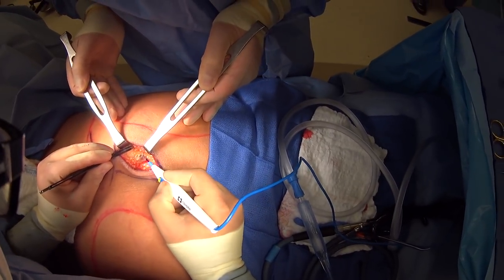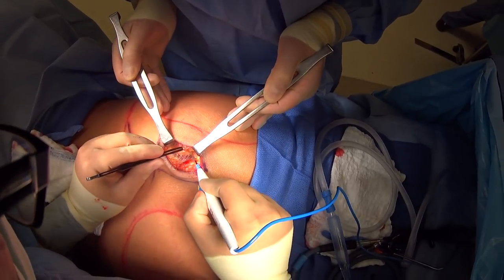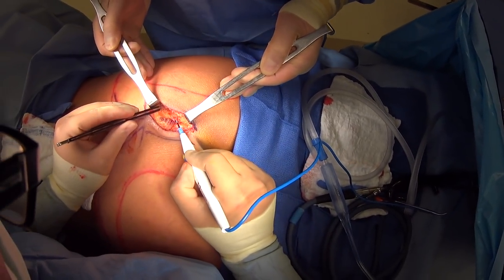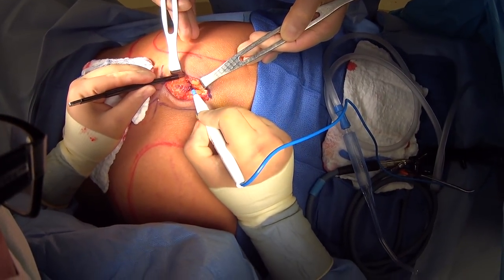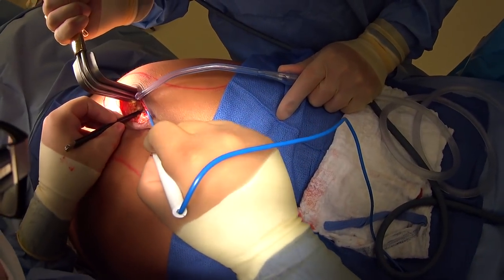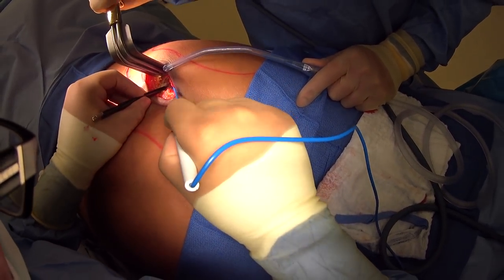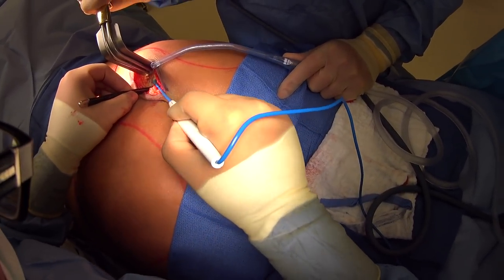You can actually see her butt shaking a little bit in the background here, which means that we're in the right place. So we'll just open this up. Here we can see the little septi between the muscle fibers and that white strong fascia — it's actually a really strong layer — and we'll just keep opening that up all the way along.